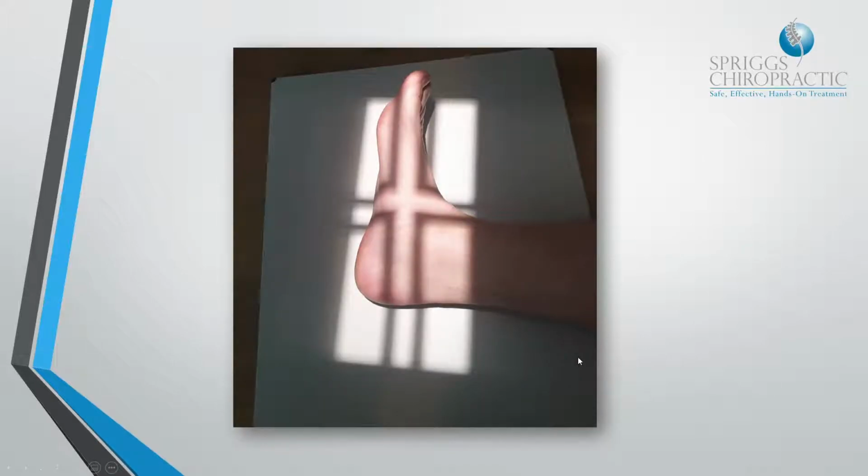So here is how you would obtain the projection. You can go a little bit more superior up the distal aspects of the leg. However, to really clear up the image, trying to get just simply the foot and ankle in the evaluation is going to give you a better projection overall. You'll have less scatter and things like this. However, you'll find some clinicians will go all the way up past the metatarsals, all the way up to roughly the sock line, just there.